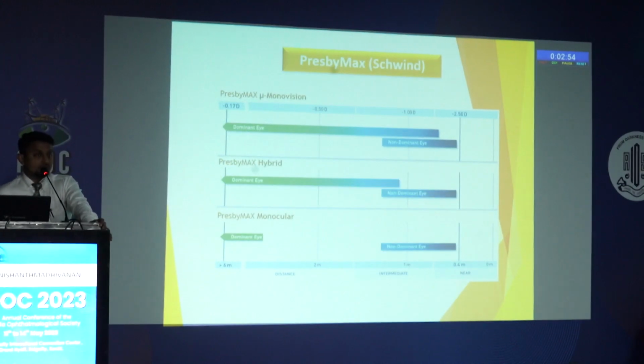The patients who are most comfortable, in which we have done this, are mainly the hypermetropes with presbyopes. I never do it for myopes with presbyopes because they always have good vision for distance and are comfortable without glasses for near. If suddenly you make sure they are able to read near but you're losing that 6/6 for distance, they're a little unhappy. So my preferred patient selection is always hypermetropes with presbyopia, and not the early presbyopes between the ages of 40 and 45. I always go up to 48 or 50, where they at least have an add of around +2 diopters or 1.75. If they just start getting one, that means after around 5-6 years we will have to recorrect if we are doing it at a very early stage.